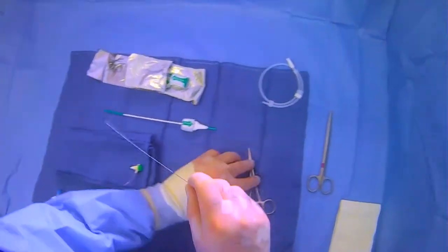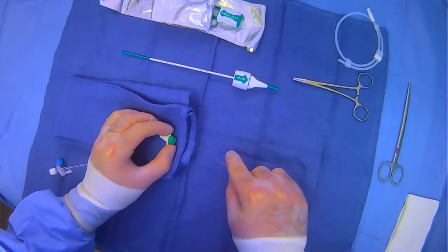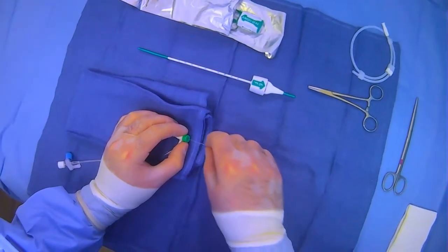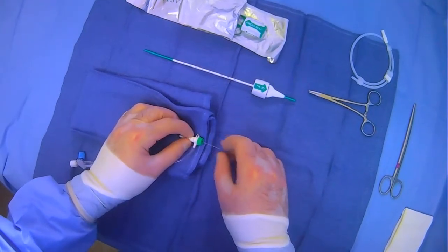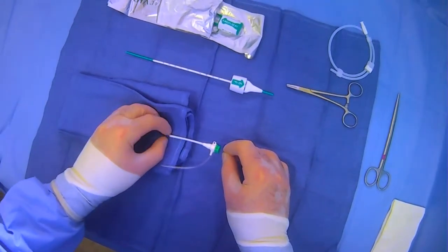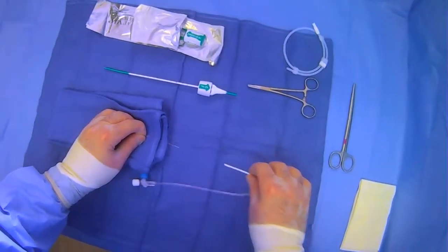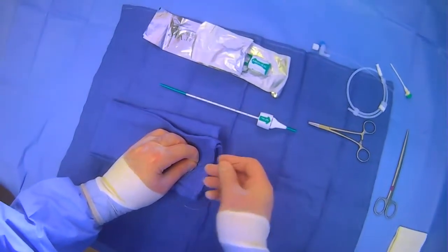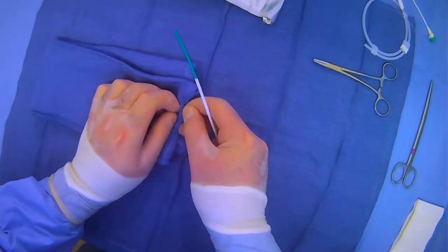What we're going to do is put our wire in our sheath here, and then take the sheath out — just pinch and pull out our sheath. Once we have the wire here, we'll put pressure down because this is an arterial site. We can put our sheath away, and either have someone help you or just load this introducer by yourself.